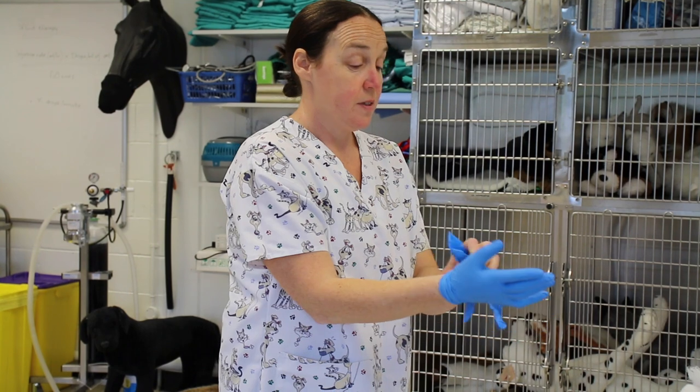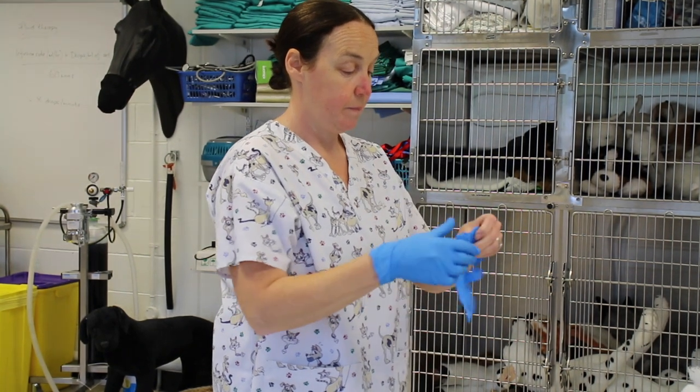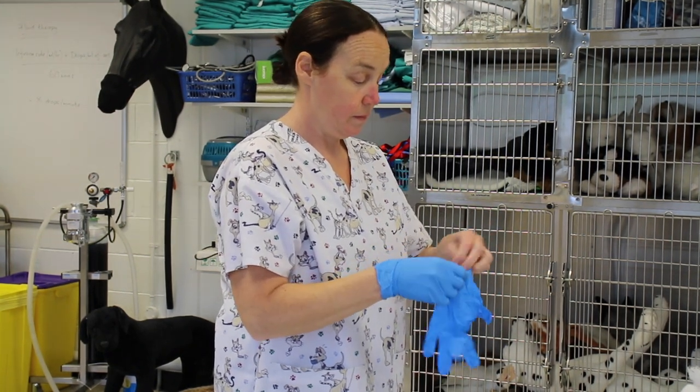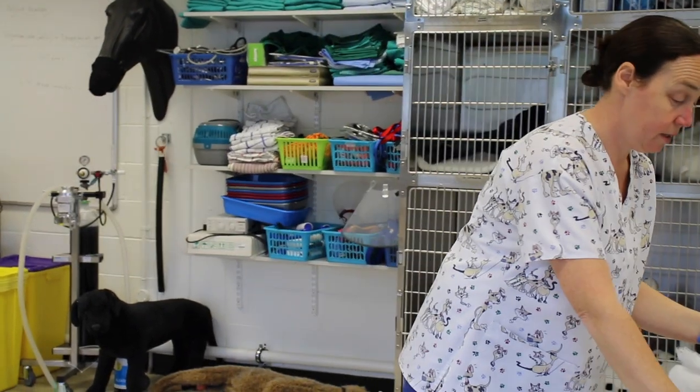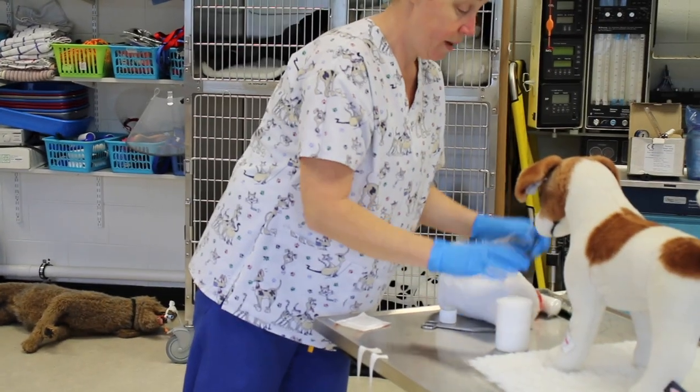Gloves on. You can pair all your equipment so you can wrap all your bandage in.